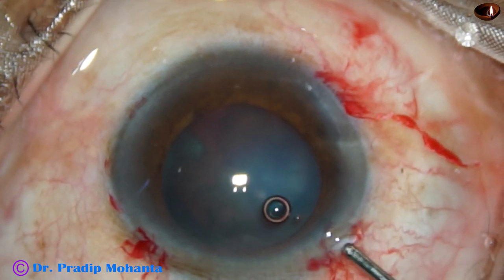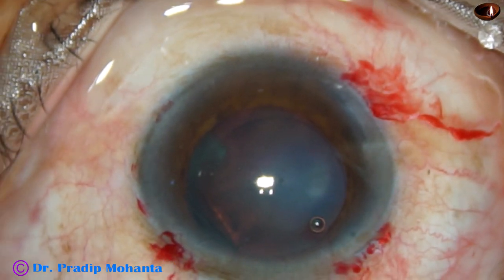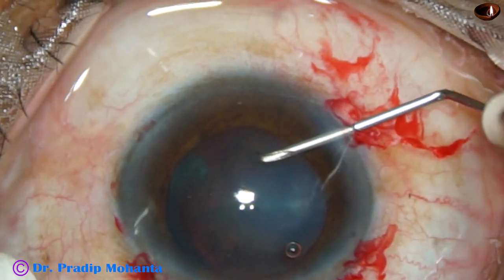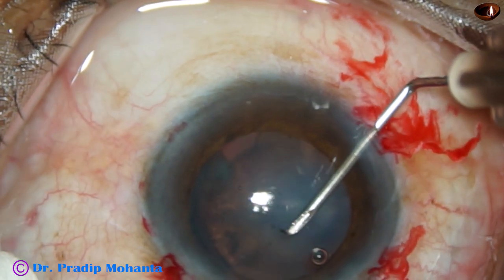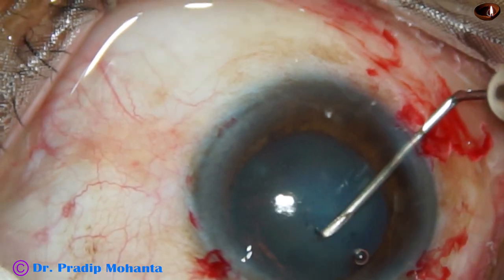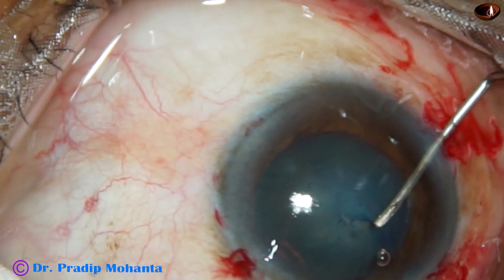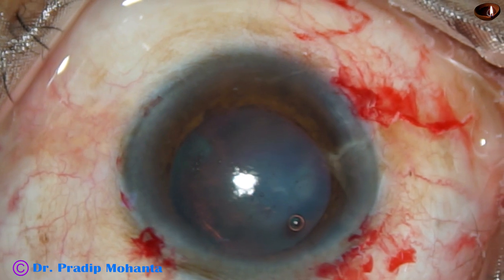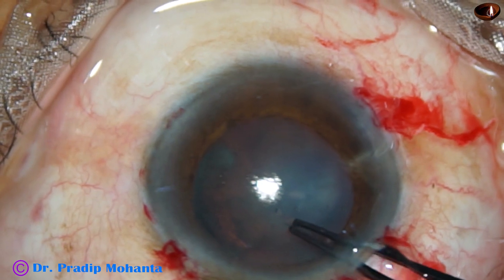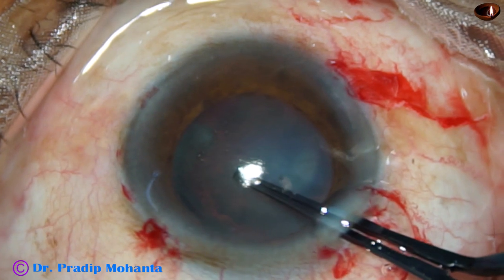Now, viscoelastic (Viscoat) is injected. I am very carefully making a cut on the anterior capsule. This subluxation is because of a blunt trauma, so the remaining zonule is strong. So I could find a tag and I have to go clockwise.